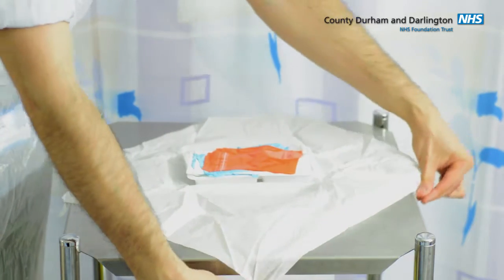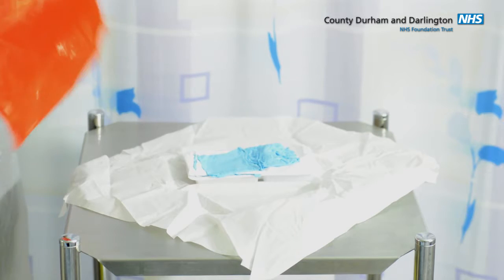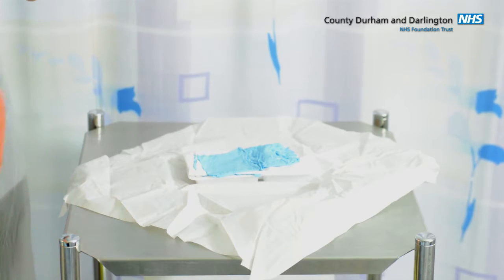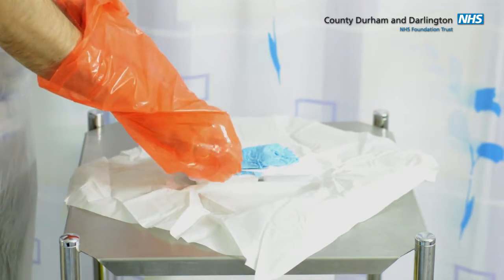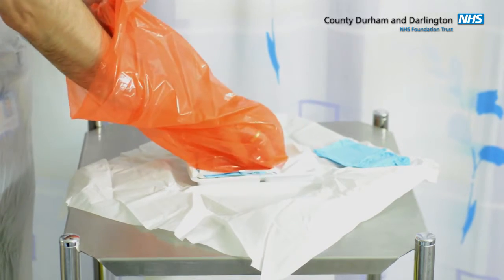The doctor will be using the clinical waste bag as a sleeve to be able to open up the contents of the dressing pack. Because you're going to be using quite a lot of equipment, you don't want it all piled on top of each other. And this allows the doctor to put into neat sections on the field that he'll be working on.